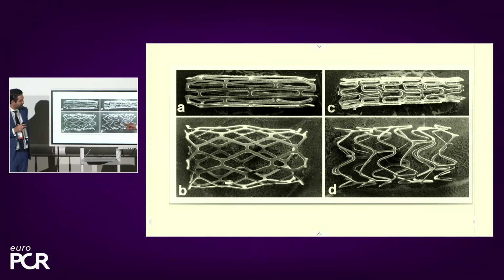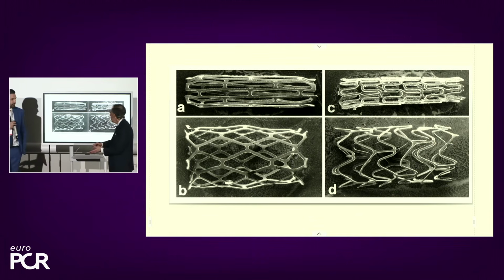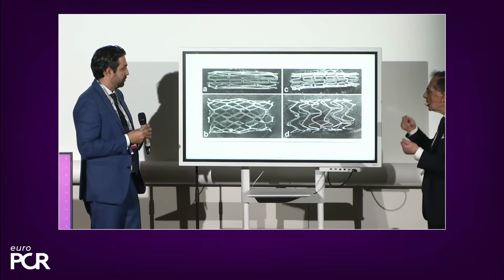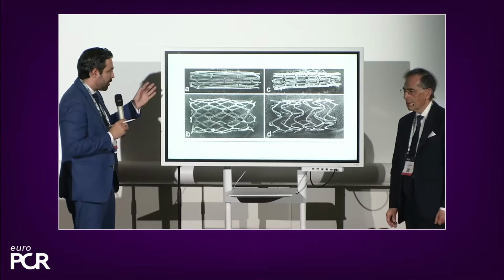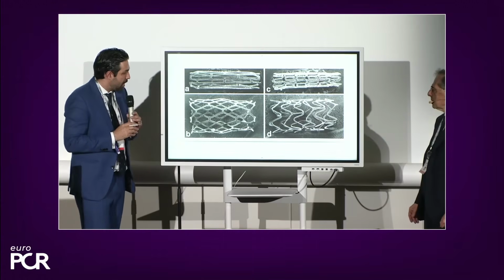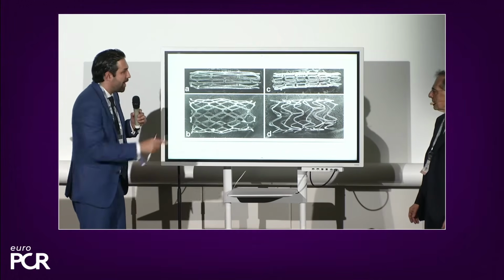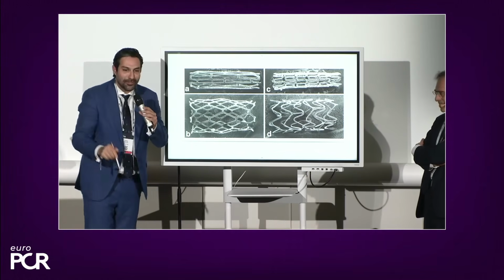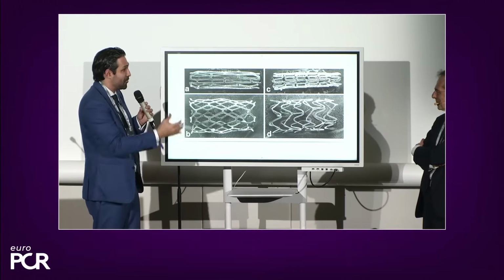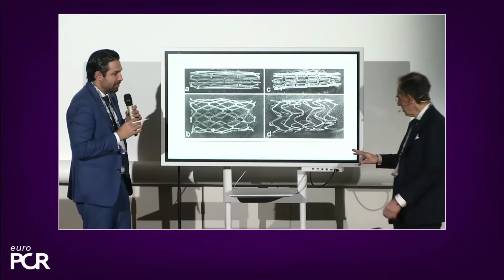Different platforms can be used, different stents, tiny stents going down in terms of thickness. Is it going to be a problem depending upon the alloy, the thickness, or not? Not at all. All alloys are easily assessed with this technology, and you can also see the morphology of the stent. Let me tell you something. I have a Japanese fellow, and I showed him the three-dimensional reconstruction, and he said, that's a science. Look at the connectors. So this technology is taking us to a place where we can identify even the type of stent just by looking at the morphology and the connectors in the stent. Super.